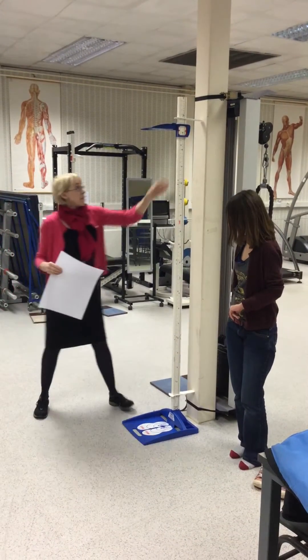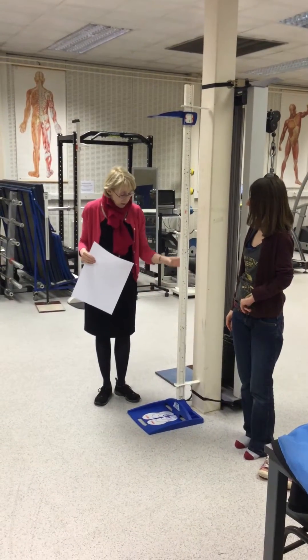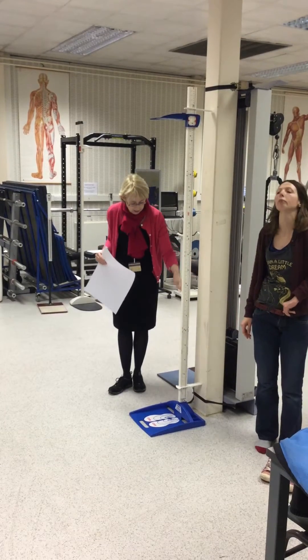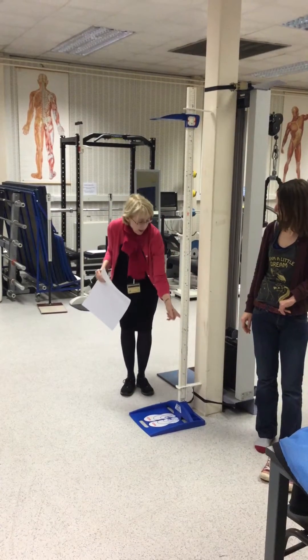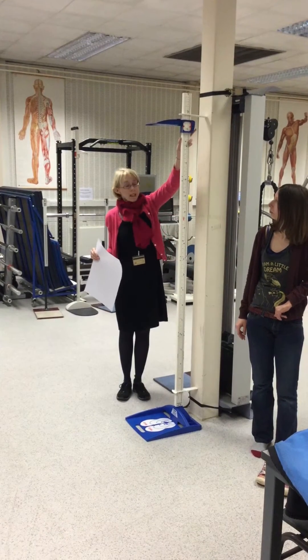So the next thing is to lift the plate up. If I just explain the stadiometer — it's a portable one — we just need to check that it's been assembled in the right way to make sure the numbers are going up from here up to two metres, which they have.